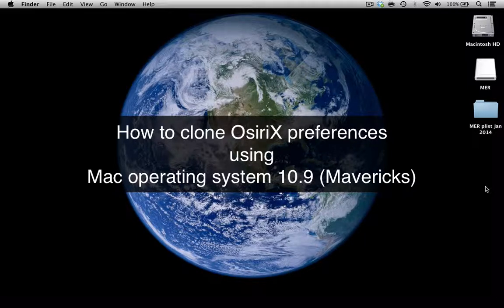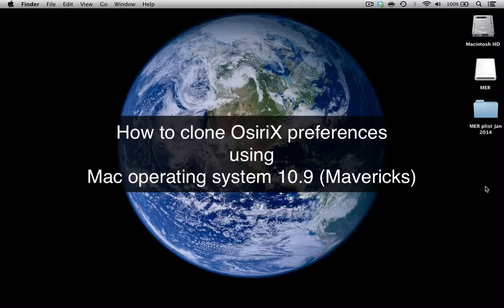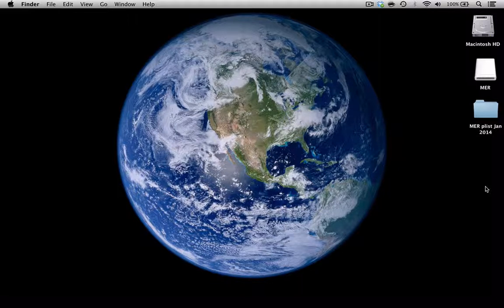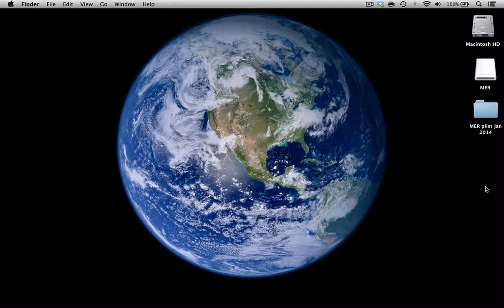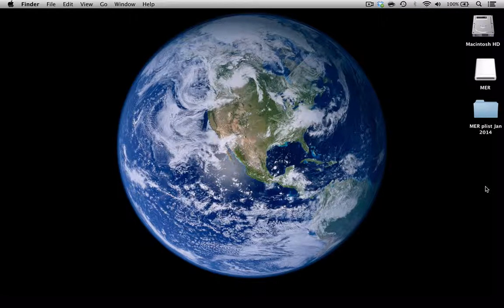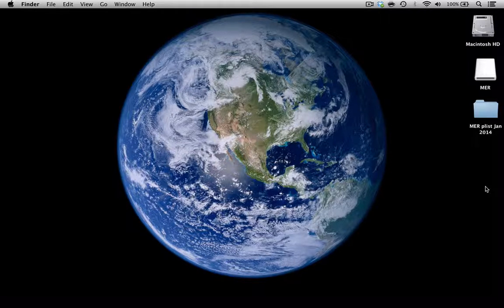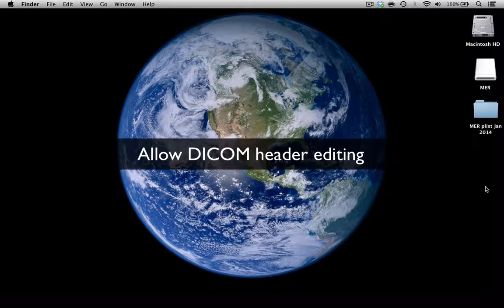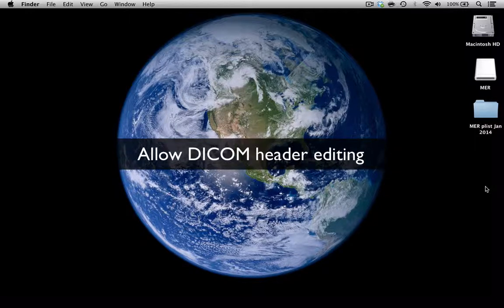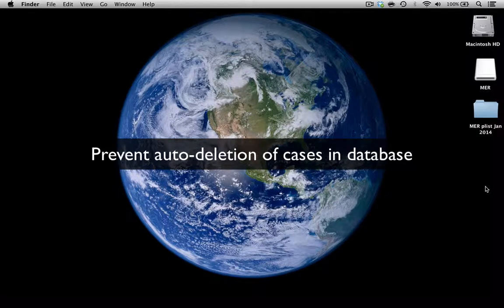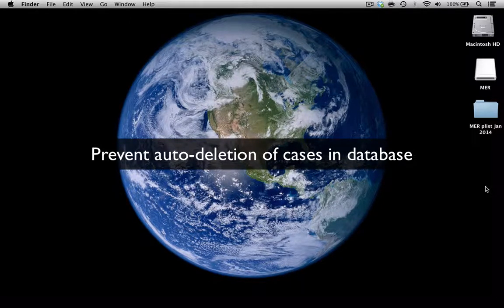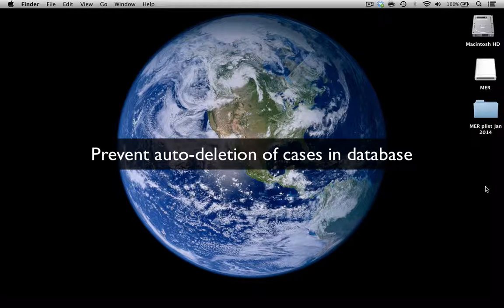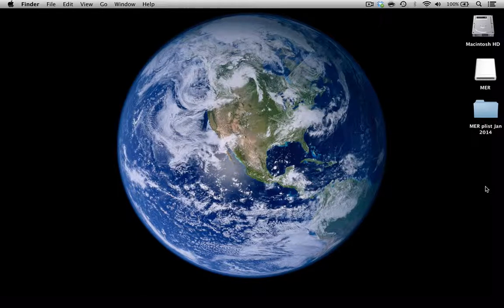Many of you who are already familiar with using OSirX for teaching purposes know how important it is to set your OSirX preferences to the ideal settings for teaching. This includes things like being allowed to edit the DICOM headers to anonymize patients and to stop cases being automatically deleted from the database.